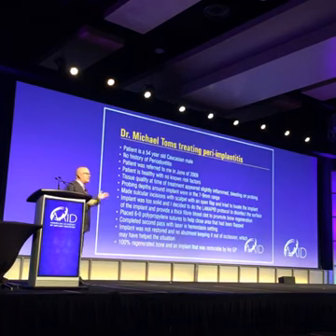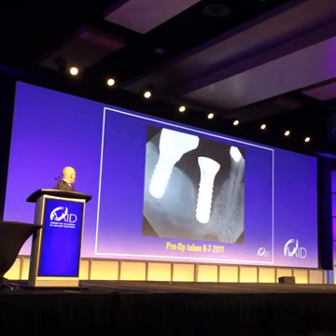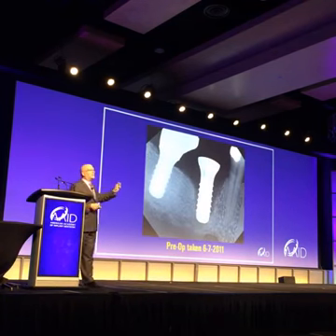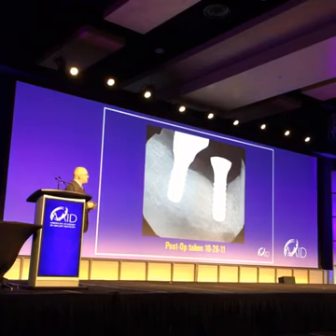Just to show you it's not me, these are some cases from other doctors. This is Dr. Michael Toms in Cincinnati. He placed an implant in 2009. It came back in 2011, and that's what it looked like. He actually tried to take it out, but the implant was still stable. So he said, you know what, I'm going to try the LAPIP protocol around implants, see what it turns out to be. There it is 4 months later.